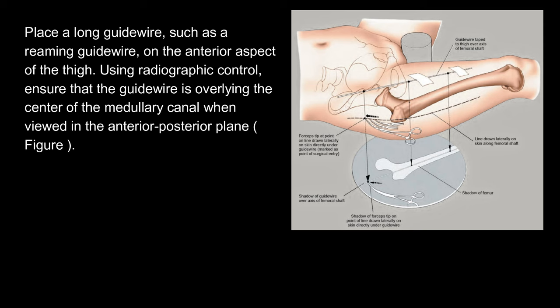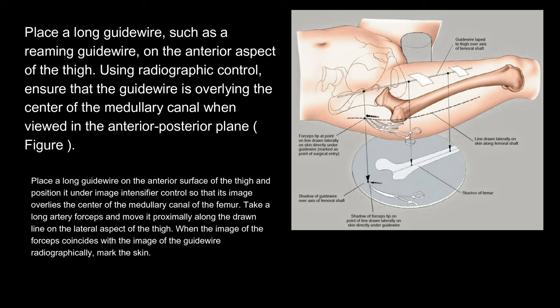Place a long guidewire, such as a reaming guidewire, on the anterior aspect of the thigh. Using radiographic control, ensure that the guidewire is overlying the center of the medullary canal when viewed in the anterior-posterior plane. Place a long guidewire on the anterior surface of the thigh and position it under image intensifier control so that its image overlies the center of the medullary canal of the femur. Take a long artery forceps and move it proximally along the drawn line on the skin. Screen this instrument using an image intensifier in the anterior-posterior plane. When the image of the tip of the forceps coincides with the guidewire radiographically, mark the skin.